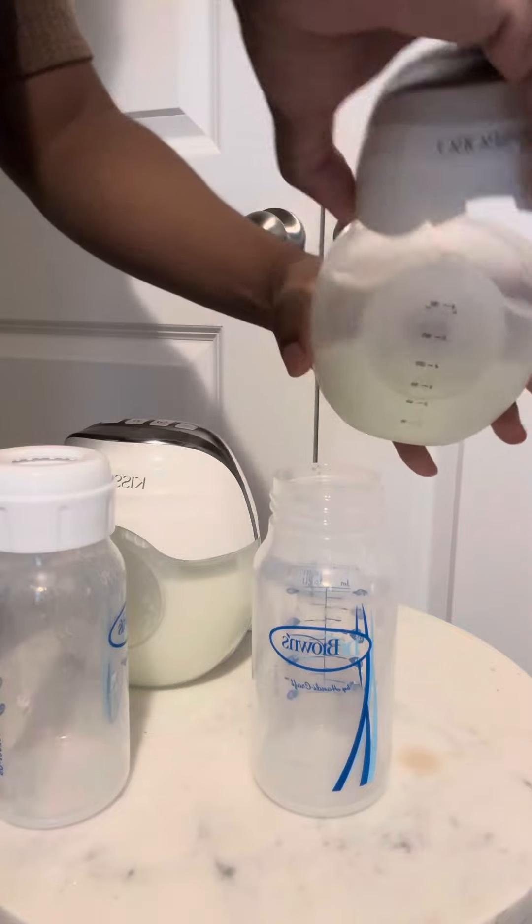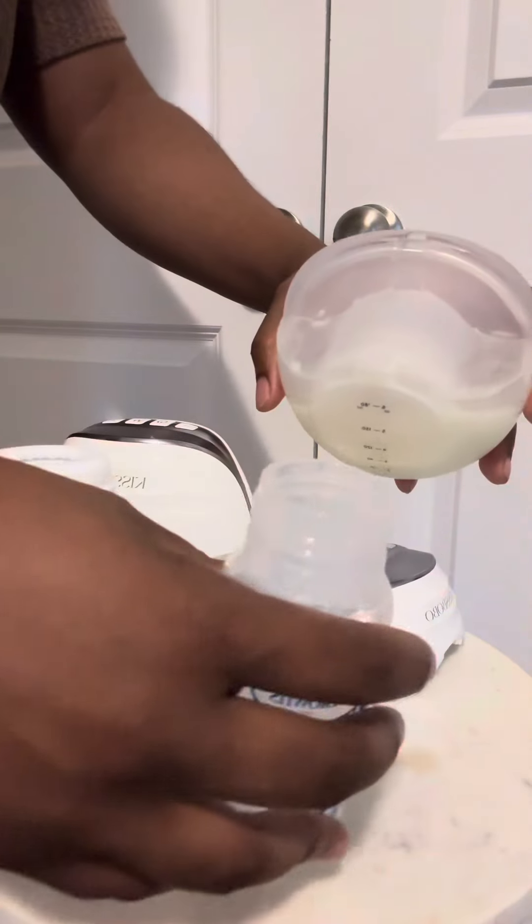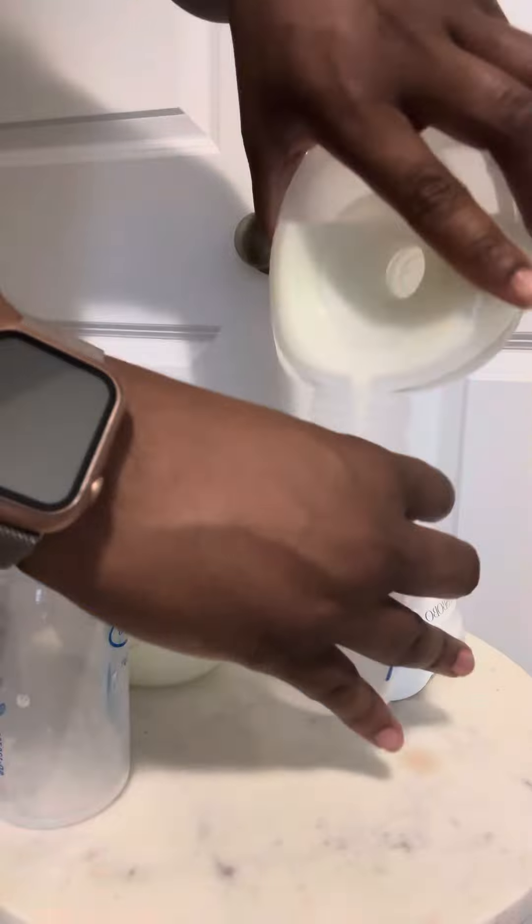So you just plop the top off and then you pour the milk into whatever container you choose.